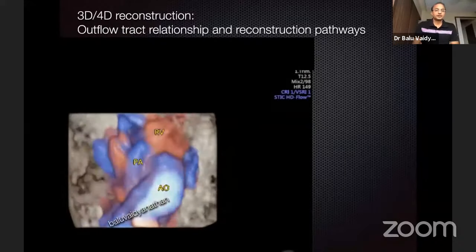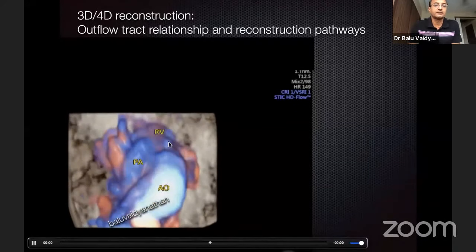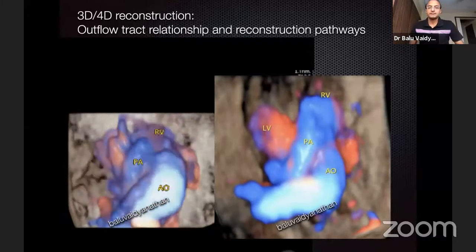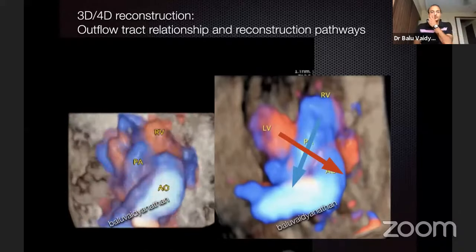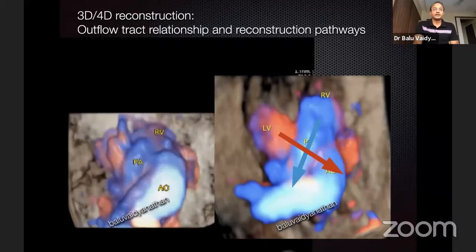So now I'm going to show both the outflow tracts in a rendered view. Here is the right ventricle over here. The aorta is a large vessel here, completely coming from the RV. The PA also is coming from the RV. And here it's almost a side-by-side relationship. Maybe the PA is a bit anterior. You can see both the outflow tracts are coming off from the RV. So the LV to aorta has to be routed this way, and then the RVOT will be reconstructed in this manner. So this seems to be a TOF-like DORV where a surgical repair is easily possible.